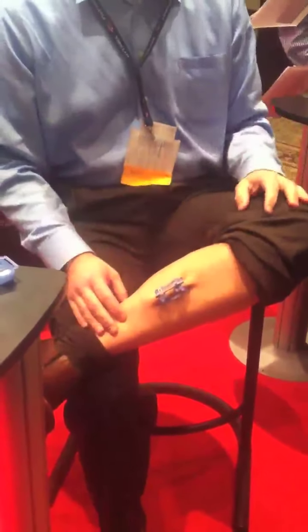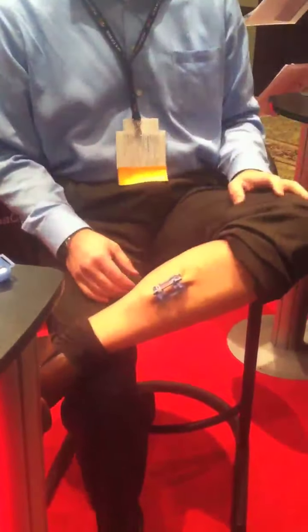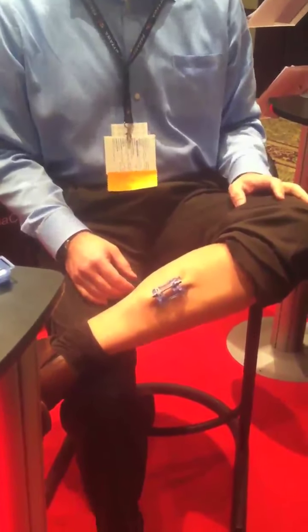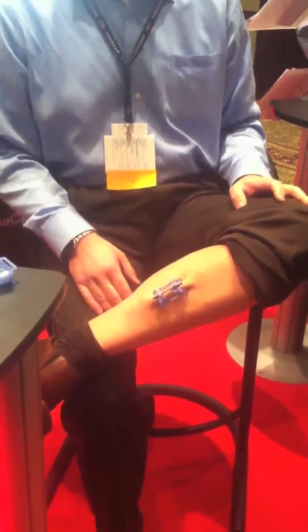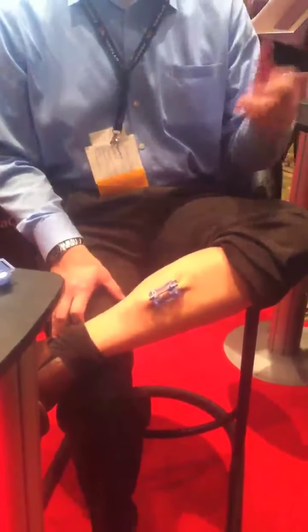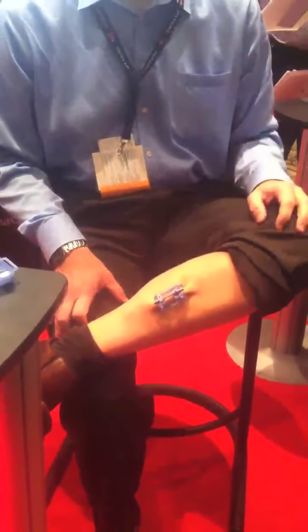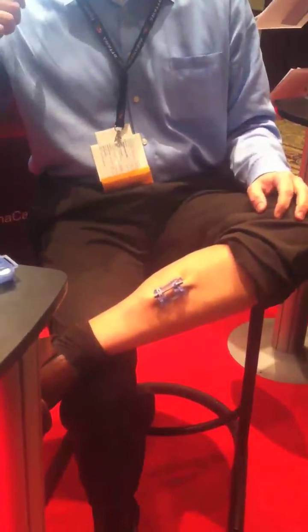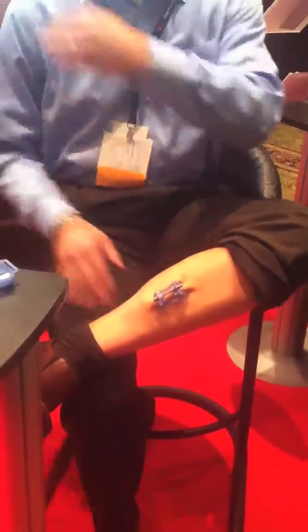If I had a big bleeding laceration, I'm not even anticipating this would be an issue. How would you compare it to an IV poke or sutures with a local? Substantially less than an IV poke. The needle insertion on a local is less, but the instillation of drugs is a lot worse. I've had two easy IOs and they're worse than this, and this is very low on the pain scale.